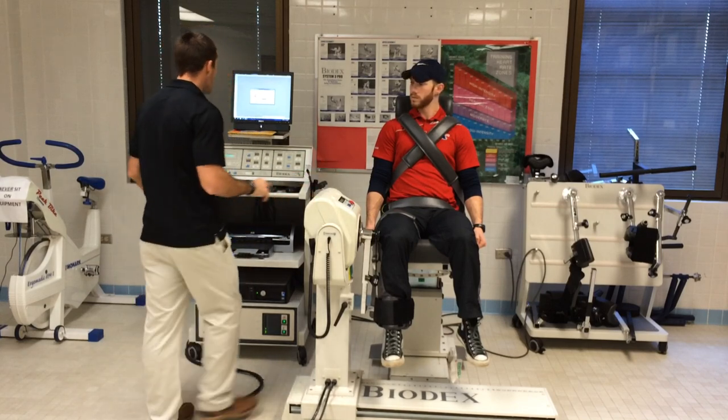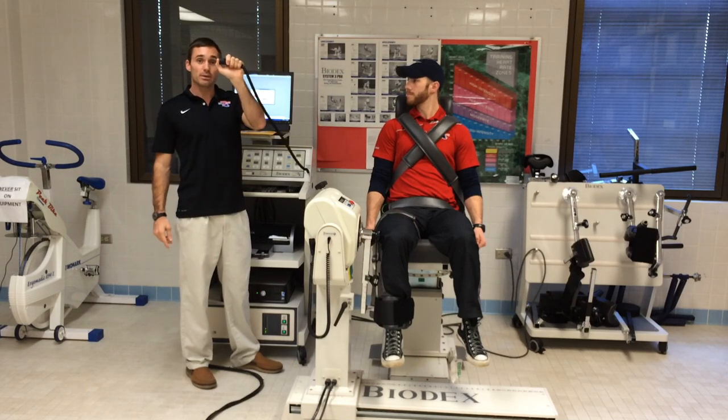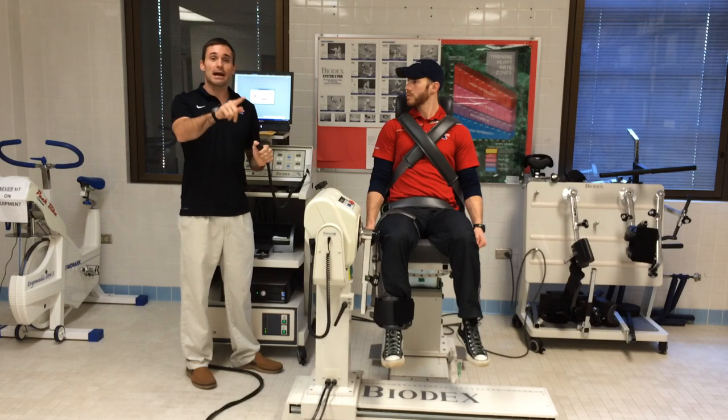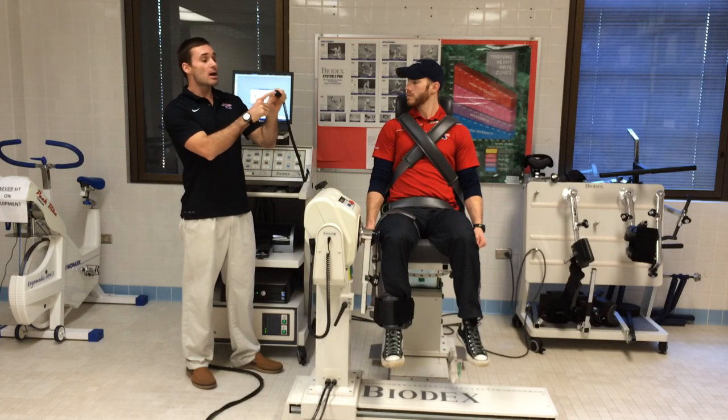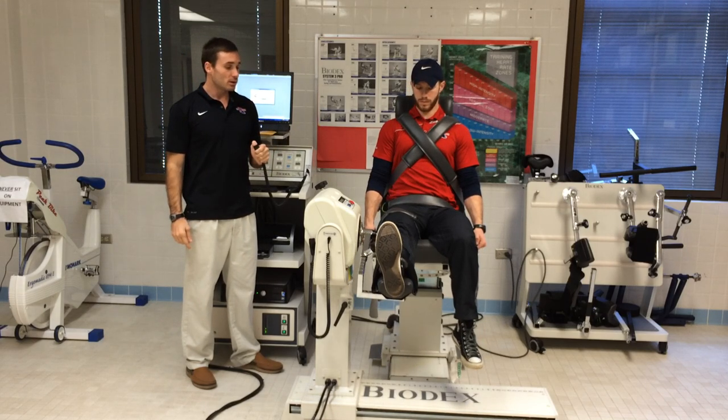So Bo, what I'm going to ask you to do in a minute, first thing we're going to grab this. This is our clicker. We're going to be using this periodically throughout this part of the test. I'm going to ask him to kick his leg out as far as he can. When he's there, I'm going to push this button to lock him in. So Bo, I want you to kick your leg out as far as you can and hold it. Hold it, hold it, hold it.